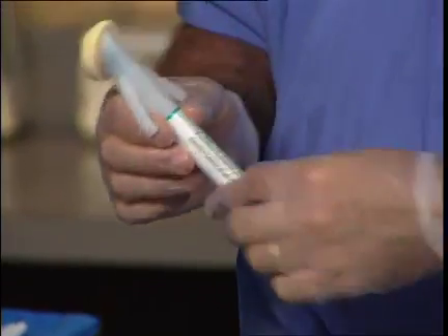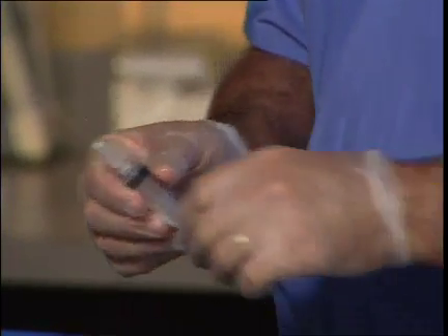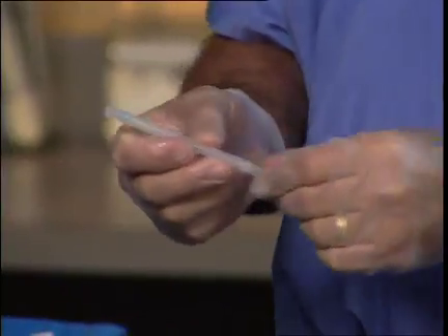To perform this particular block, the following equipment is necessary: chlorhexidine prep, 1% buffered lidocaine with a 1½ inch 27 gauge needle, a 25 gauge 3½ inch spinal needle, and a 10 cc syringe containing 7 cc's of 1% lidocaine with epinephrine or ¼% bupivacaine with epinephrine.